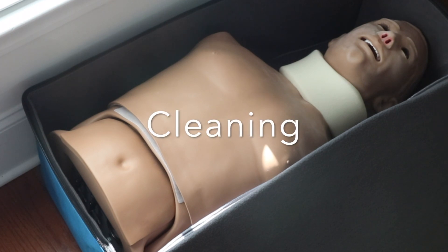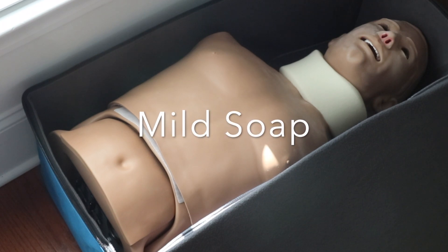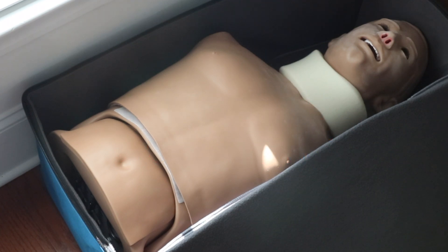When you're done with the mannequin, make sure you clean it. It needs to be cleaned with mild soap — Joy dishwashing detergent works really well. Whatever you do, do not use Goo Gone. That will totally destroy the plastic and the rubber.